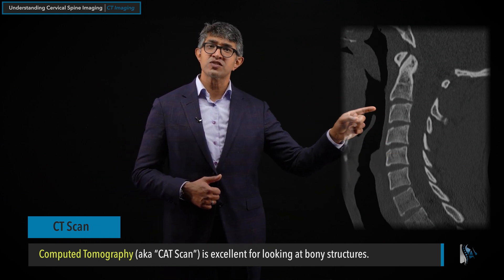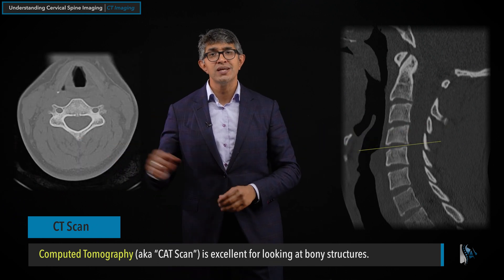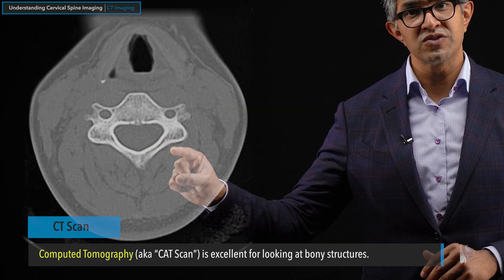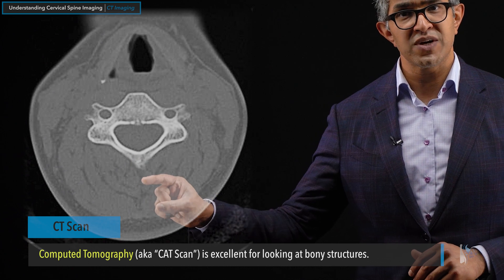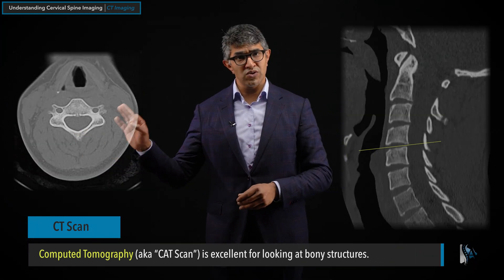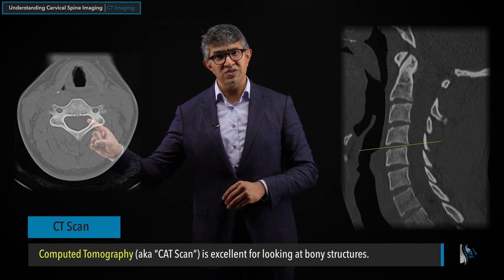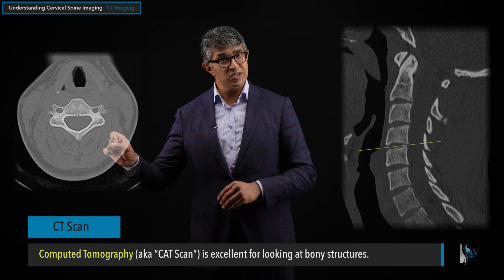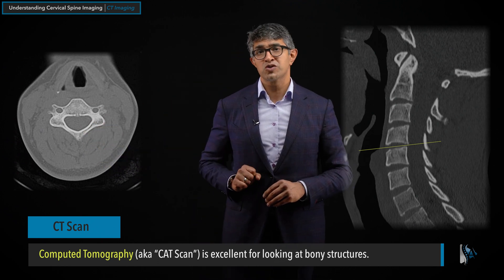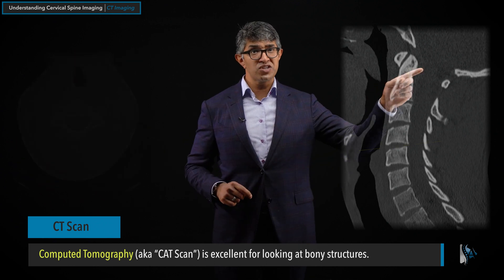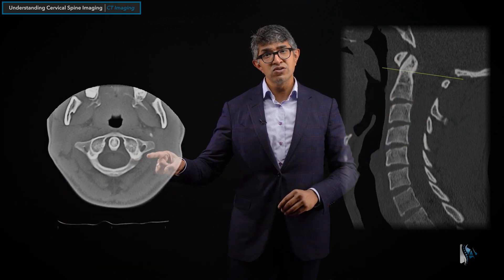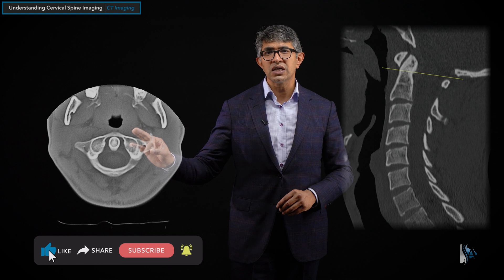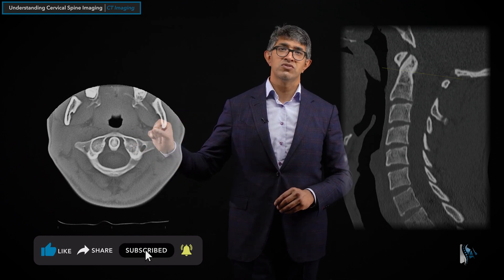If you take a single slice through here at C4-5, you get an axial image like this. You're looking at the vertebral body in the front, the lateral masses, the lamina and spinous process — structures we talked about in the first chapter. Right here you can see the triangular-shaped spinal canal where the spinal cord sits. You can't see the spinal cord itself, but you can see where it goes. These are high-resolution images, and if you take one up very high — for example — you get an image showing C1-2, the lateral mass of C1, C2, and what's called the odontoid process. You can get really clear pictures of what the bony architecture itself looks like.